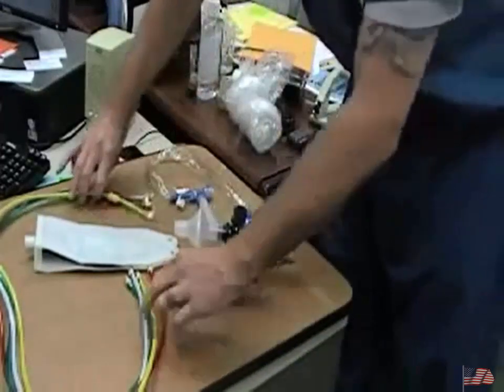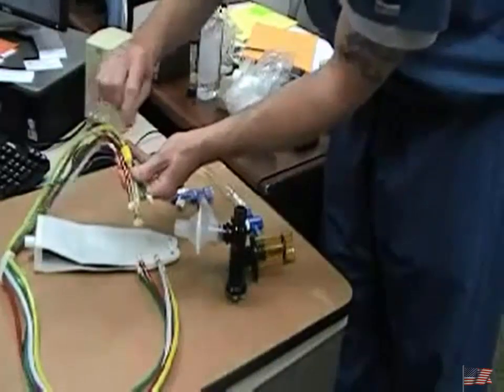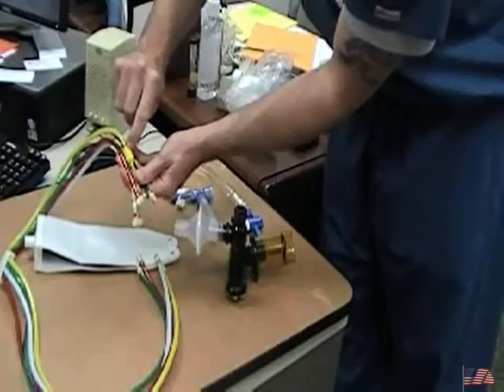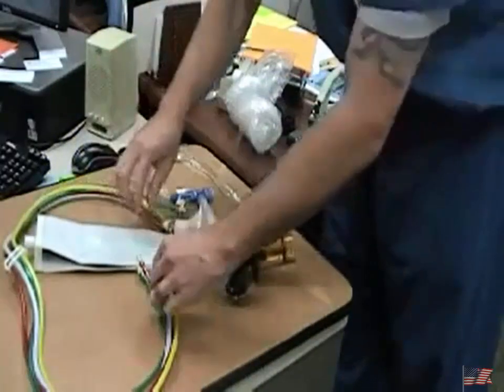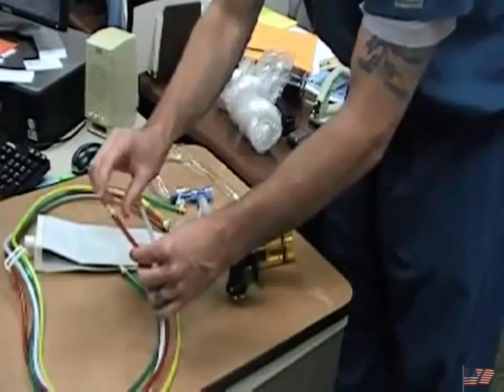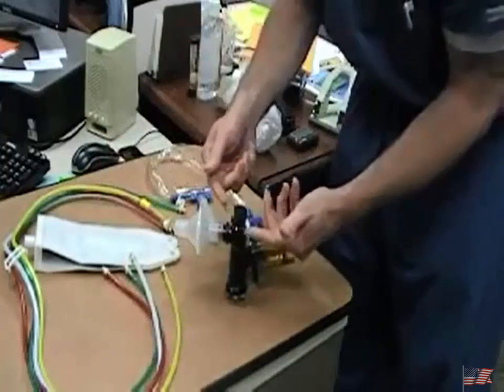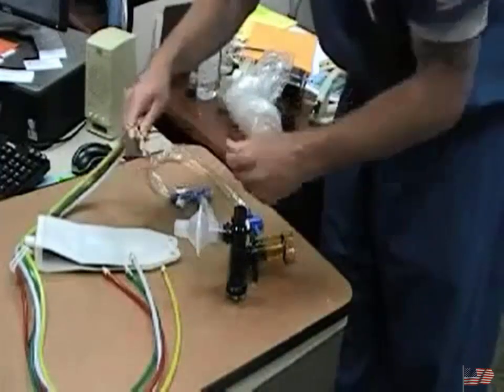And then here is our circuit. And if you notice, it's color-coded as well, which is a wonderful thing. We've got this little arrow on this piece here on this filter. That always goes towards the patient. Usually on the red line there'll be a small filter as well. And we would like to put that in, usually as close to the patient as we can, but somewhere along that accessory line would be ideal.